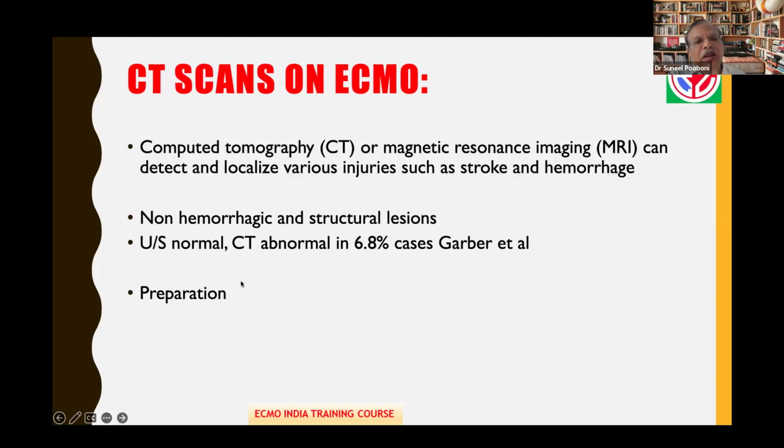For non-hemorrhagic or structural lesions, when ultrasound was normal, CT was abnormal in 7% of the cases, by Garber et al. But once the anterior fontanelle closes, as there is no other window, it is very important for us to monitor the brain on CT scans.